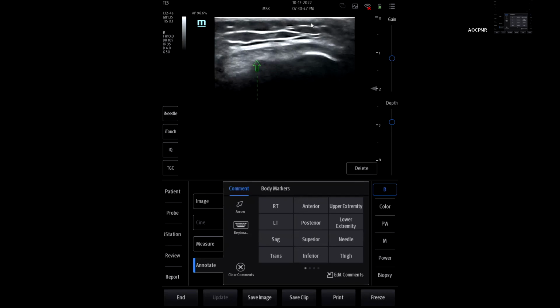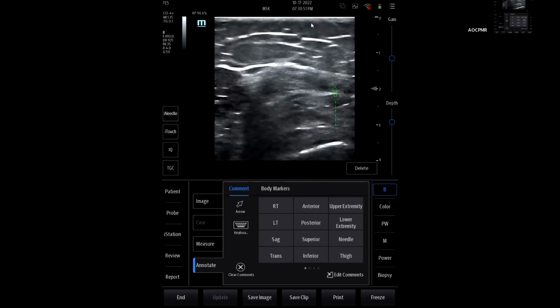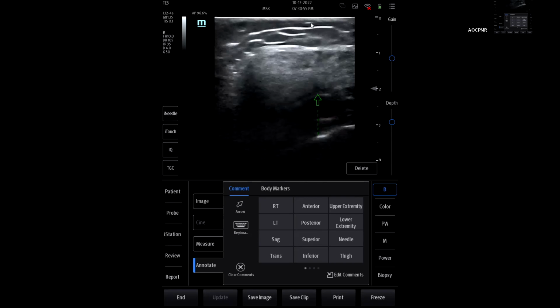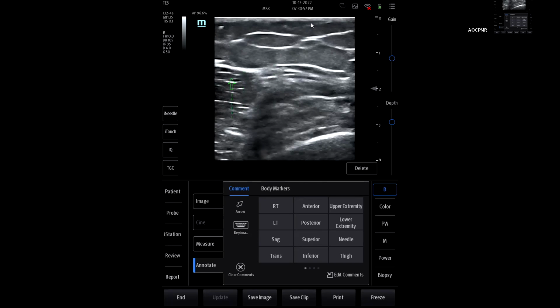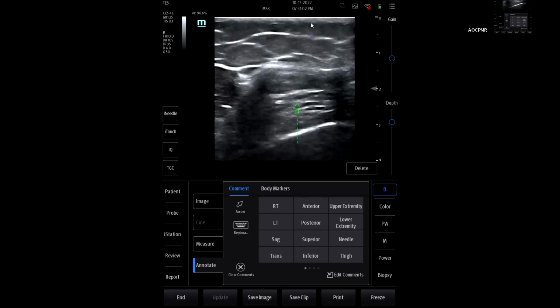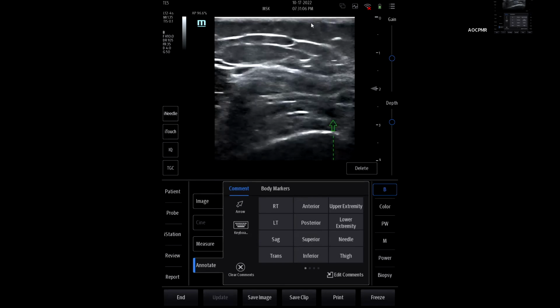It's patella, and you see the quad tendons inserting, starting to come off. This is all quad tendon, quad tendon, quad tendon. You're going to start to see the different muscles of the quad peel off of it, on top, on either side, and underneath eventually, if we keep traveling north. So that's our quad tendon in this evaluation.